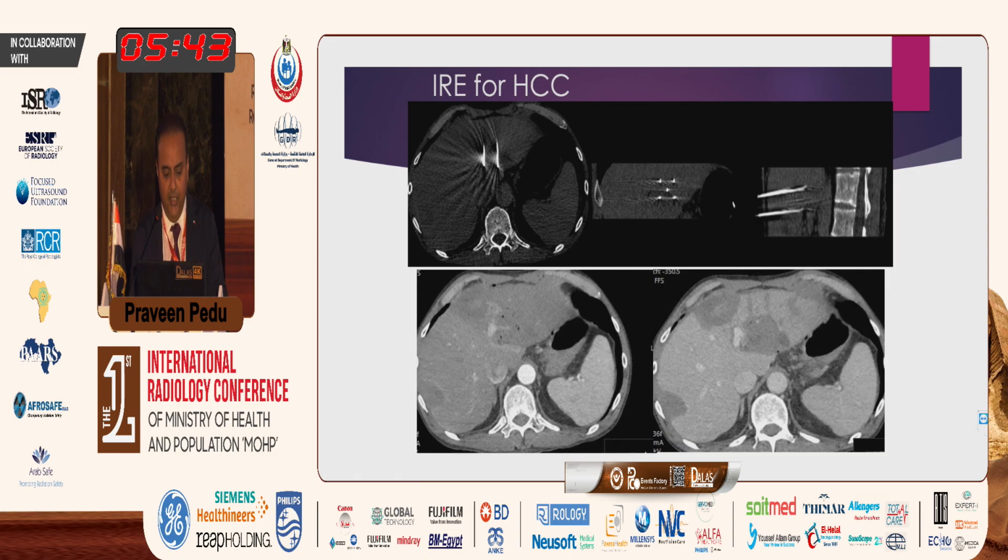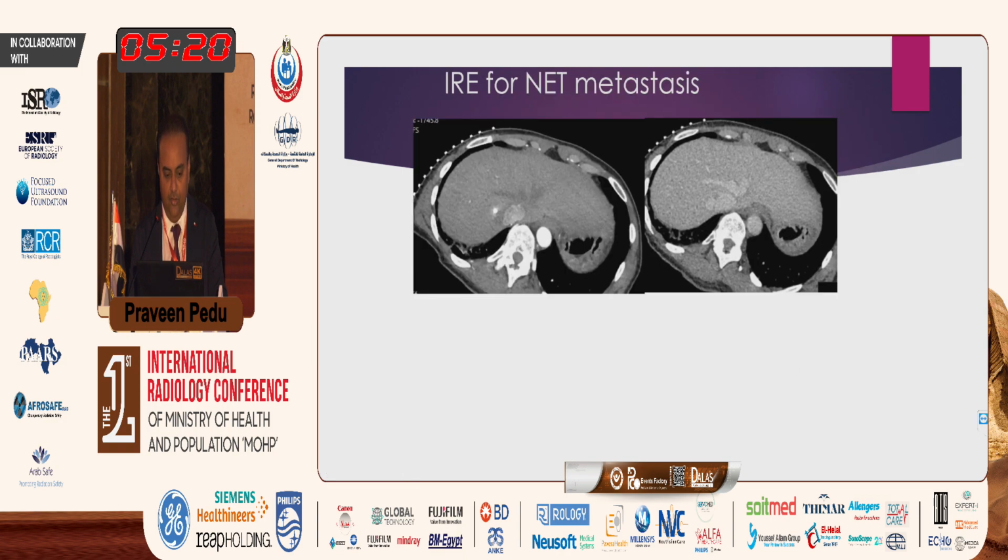And this is the immediate post-treatment CT scan. So we treated this area with IRE. We treated the other 2 areas with microwave ablation at the same sitting. And you can see that the treated zone, the ablated zone, looks completely encompassing the tumor, but more importantly, the vessels, the portal vein and the bile ducts within the treated zone are left unaffected by the treatment area.